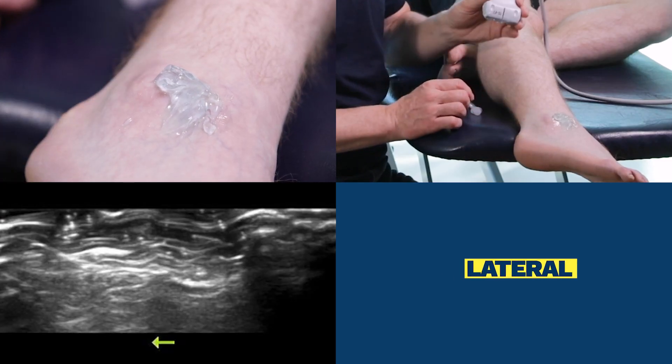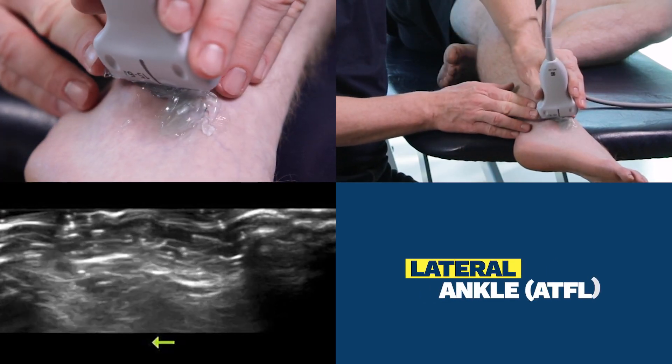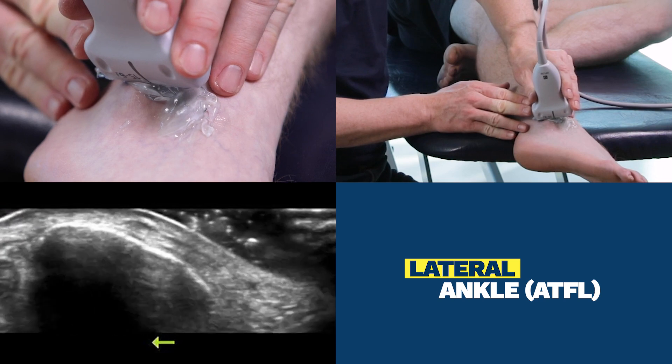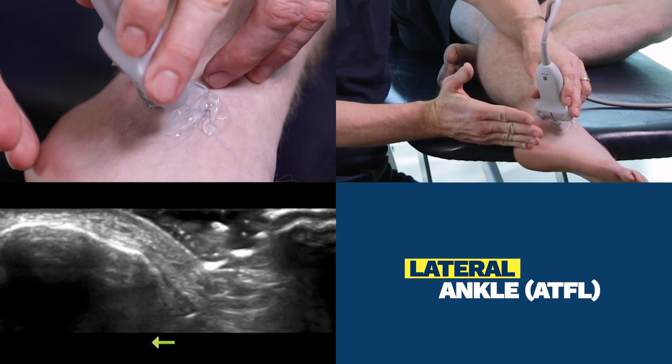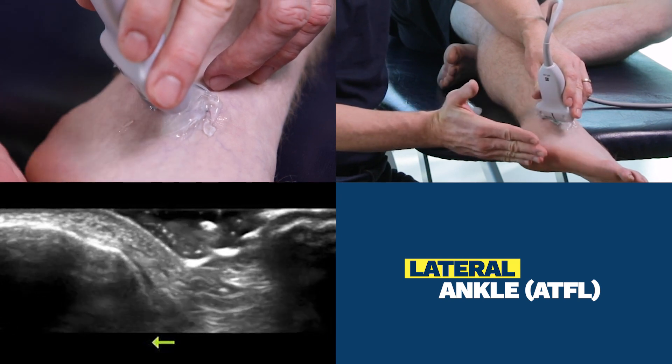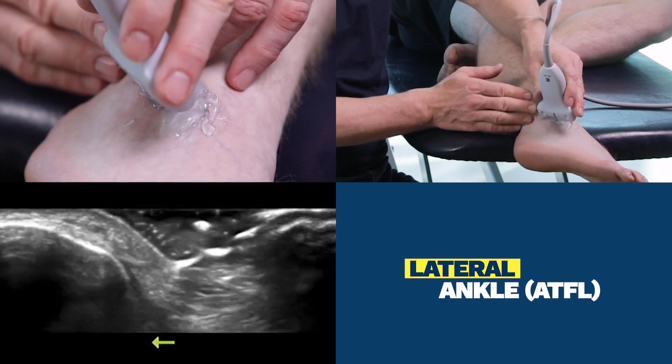The landmark is going to be the lateral malleolus. I'll get that in the center of the screen now. The orientation of the probe is going to be horizontal, or completely parallel to the bottom of the foot.